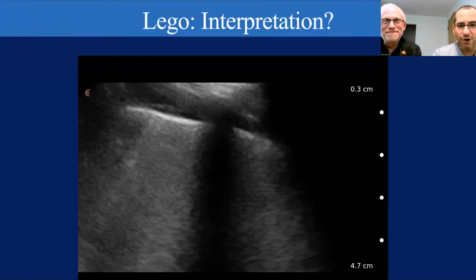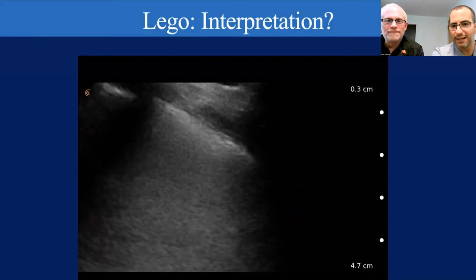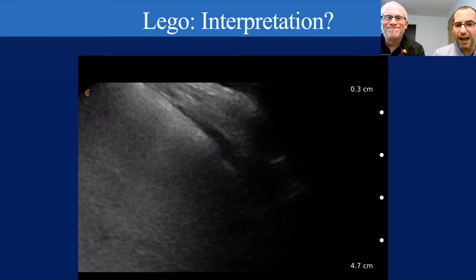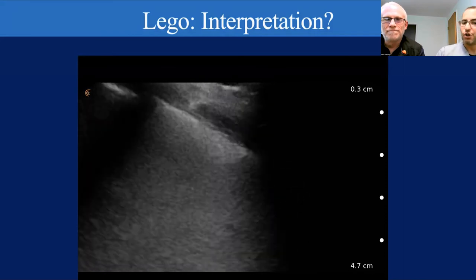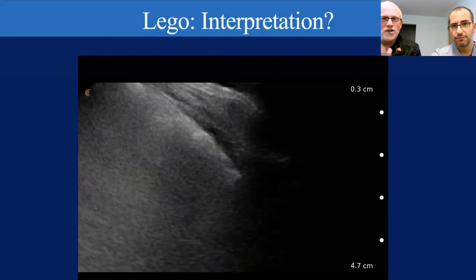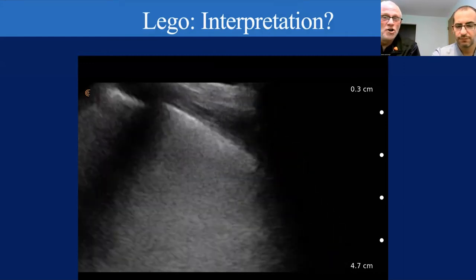So back to Lego, and we can see here, Dr. Boysen, I'm looking at this and woof. I see so many B lines in this clip right here. They're coalescing. It gives me a white sheet, and I feel like I can see a little titch of pleural effusion. Now, that's not a skill I would expect our beginner point of care ultrasounders to notice, but I think I see a little bit of pleural effusion there. All right. So we're going to focus on the more obvious thing that you pointed out first, Dr. Chalhoub. We're going to come back to that pleural effusion. Good to note that you suspect it.